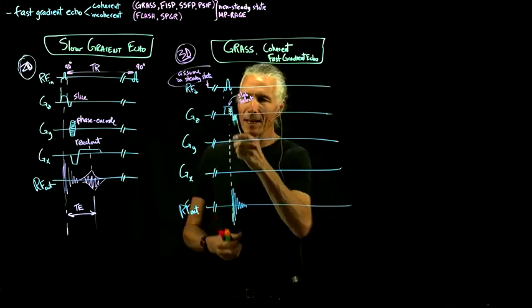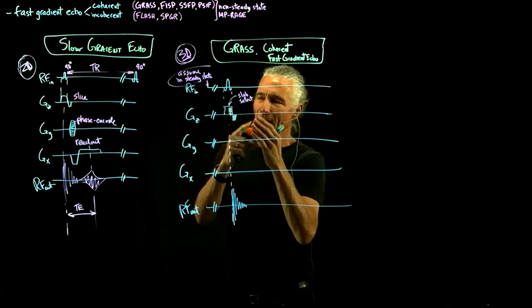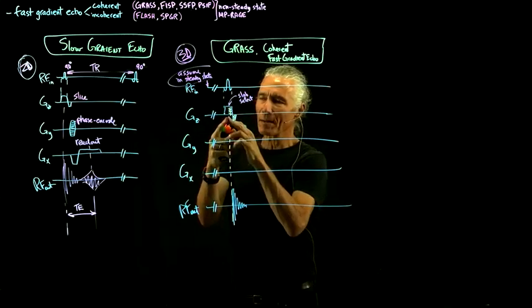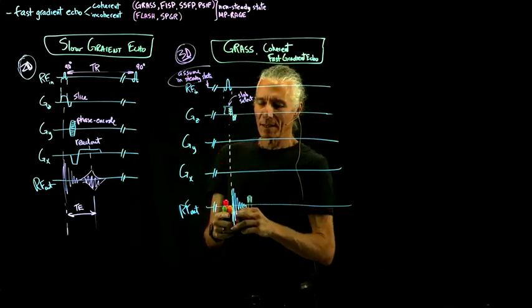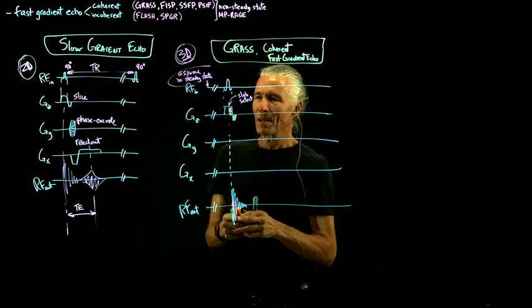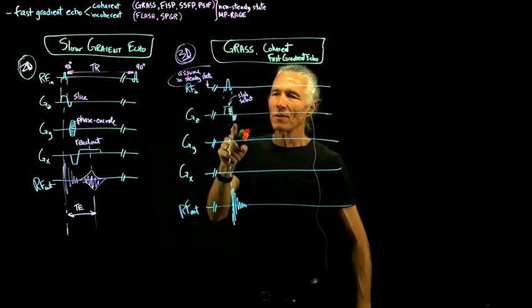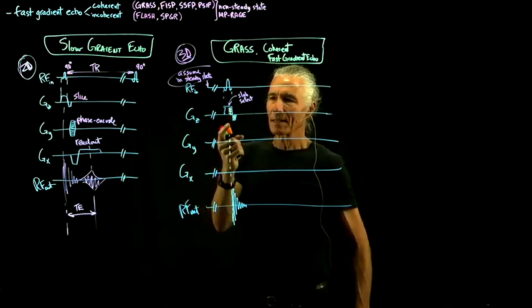At the very beginning, not too many spins are lined up with each other, and at the end, a lot more are lined up, and you can approximate that by pretending the RF pulse started at the very middle of it. So then the amount that you have to actually fix starts from the middle.